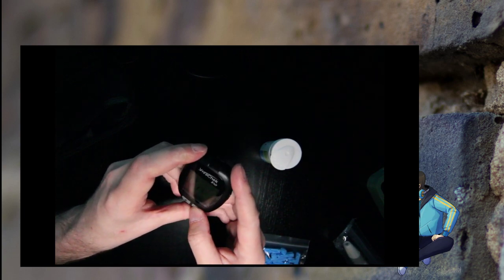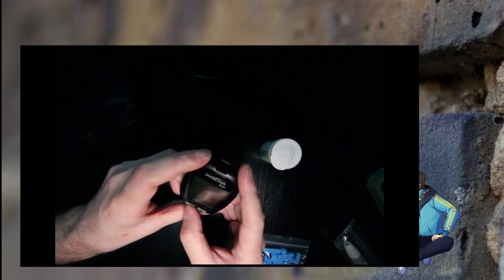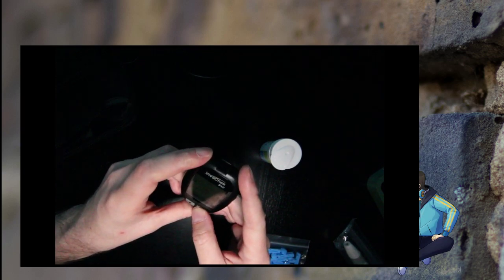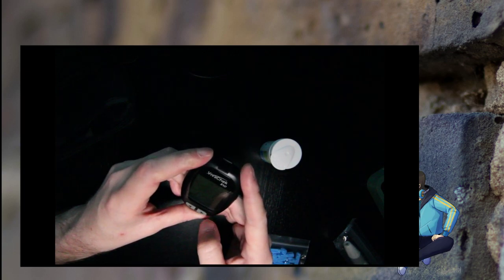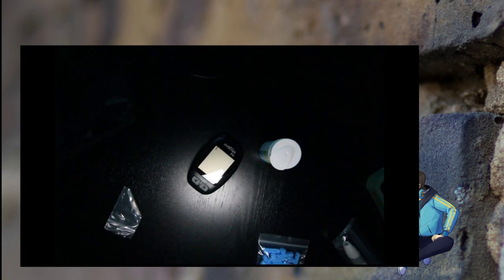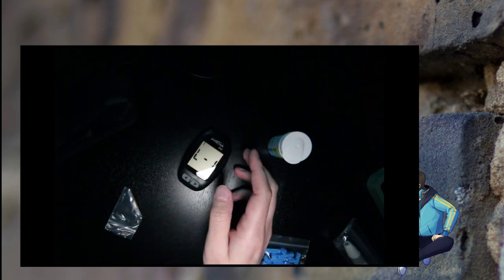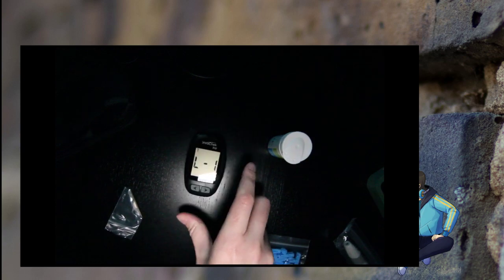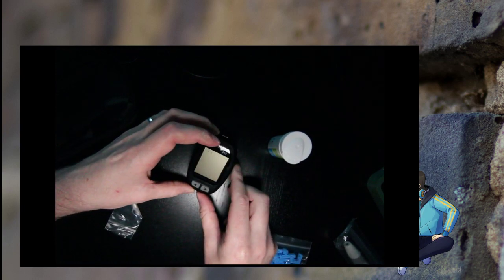Beep off. I don't really want the beep. L1, L2. I have no idea what L1 and L2 does. Oh, I now configure it for L1. There's a bunch of things coming up, and then it says commit for the thing.